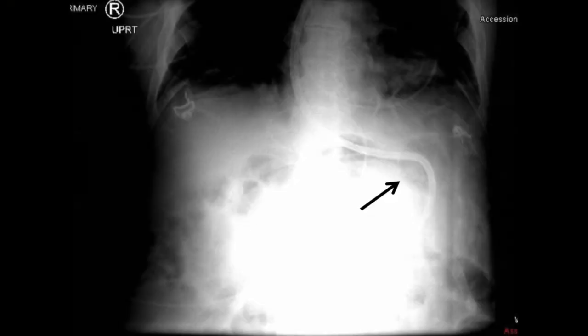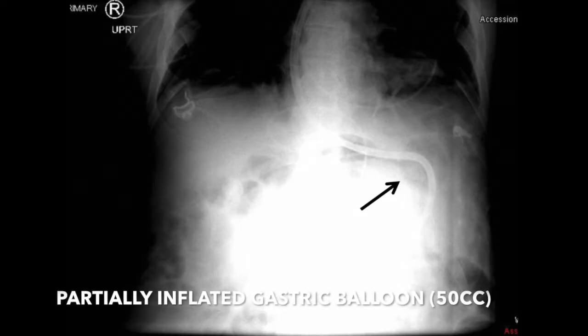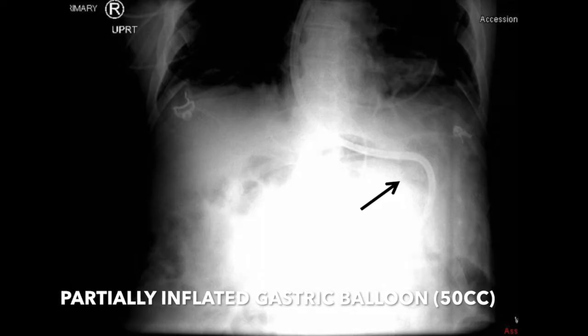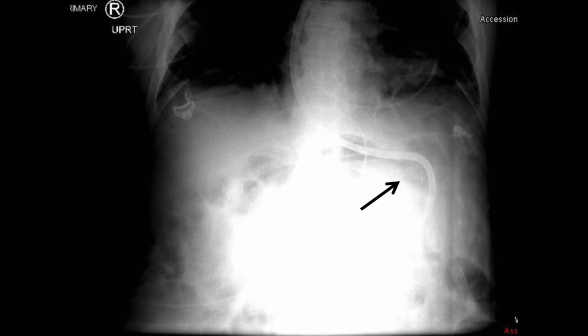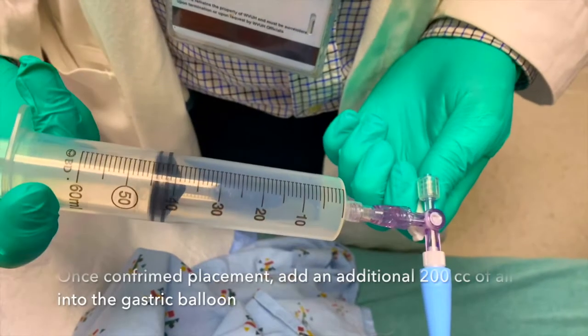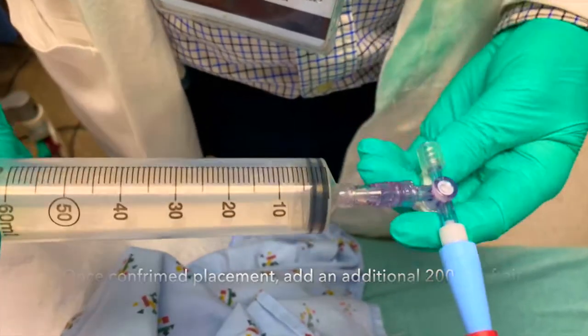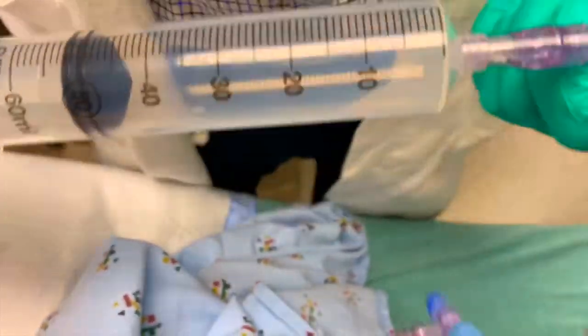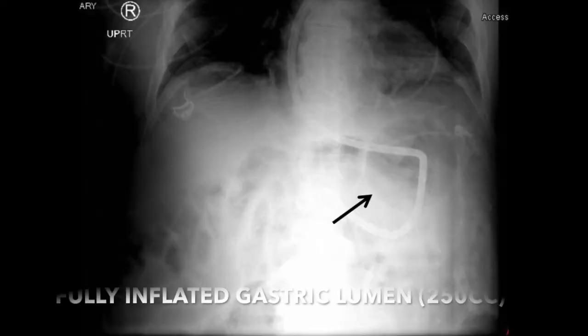Once you have injected the air, take an upper abdominal x-ray to ensure the gastric balloon is within the gastric lumen. It is vitally important to make sure the tube has passed through the esophagus and not into the airway. If you do not see the lucency of the gastric balloon in the stomach, deflate the balloon and advance the tube further. Add another 50cc of air into the balloon and repeat an abdominal x-ray to confirm placement. Once confirmed, add another 200cc of air into the gastric balloon.